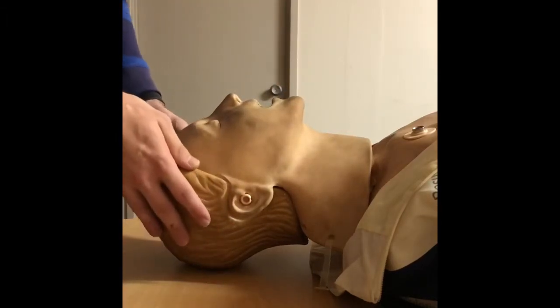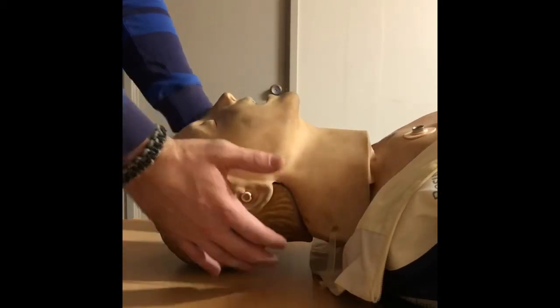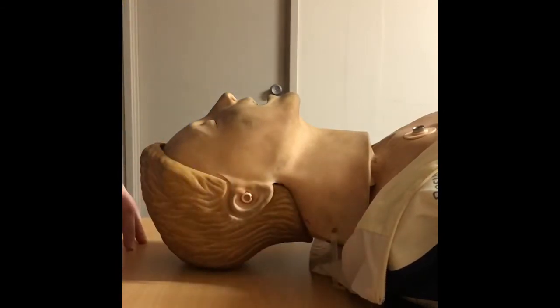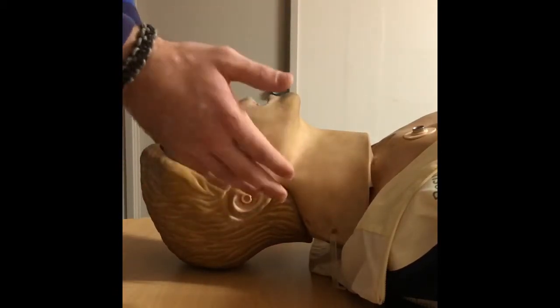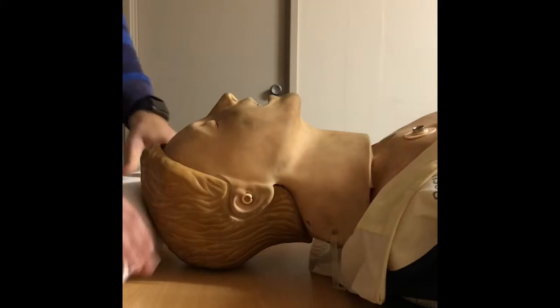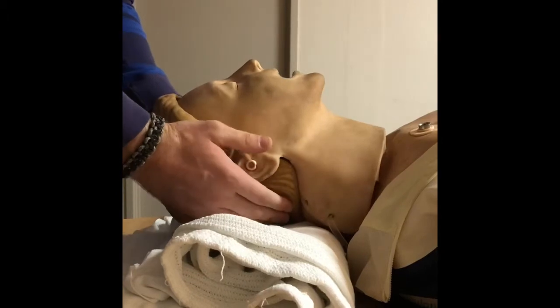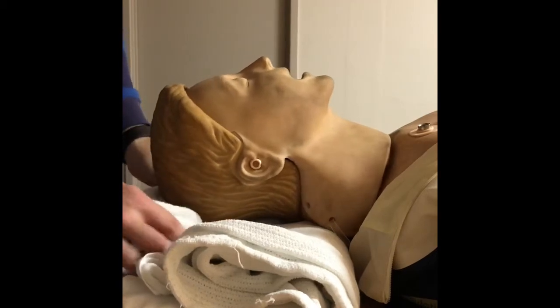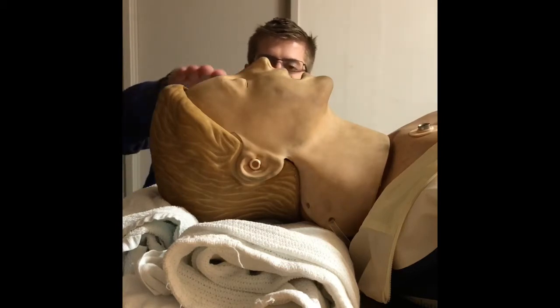So how we can do this, that can be corrected by cushions or towels elevating the head. If there is an obese patient, we can ramp them by putting blankets and towels underneath the shoulders there and then bring the head up. Ideally 30 degrees would be perfect, but we don't work in a perfect world. So I'll just demonstrate with a blanket. So we'll place this on the patient's head there. This is as anterior as we can go. What we want to assess for as well is this patient's face is parallel to the ceiling, which we have a pretty good angle there.